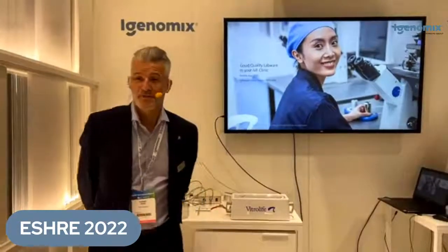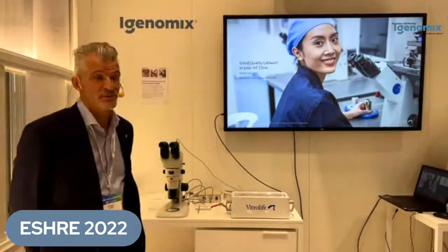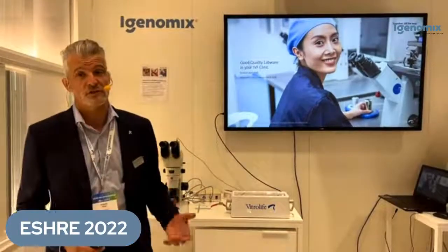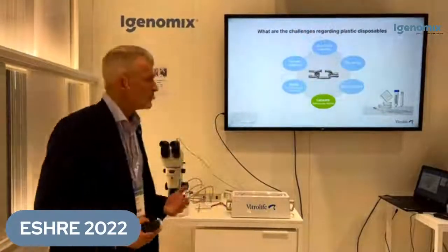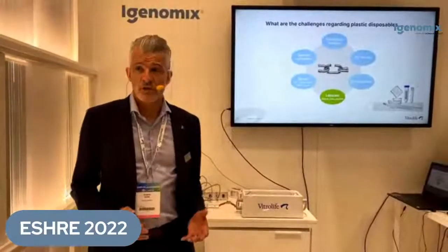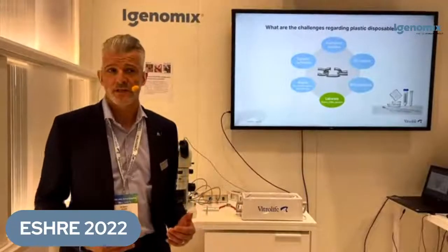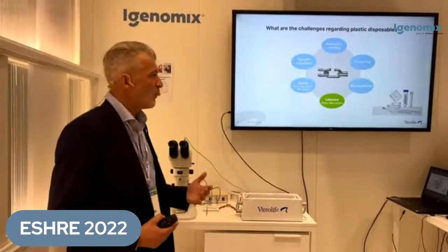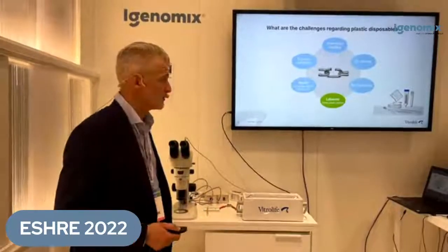Okay, good morning everyone, and it's great to be here at Milan and to talk to you this morning about my experiences with Vitrolife's labware and the importance of using good quality labware in your IVF program. So, we know that during the IVF process, our gametes and embryos are going to come into contact with many different materials, from needles at oocyte collection, oils, culture media, and especially dishes and plasticware.